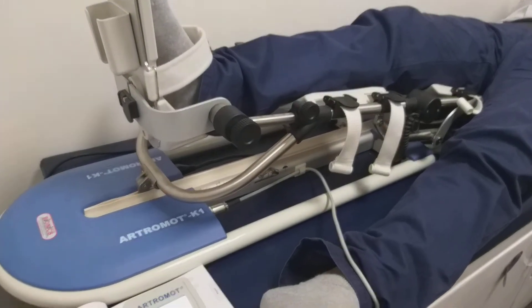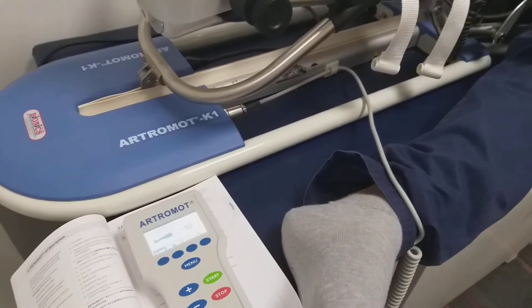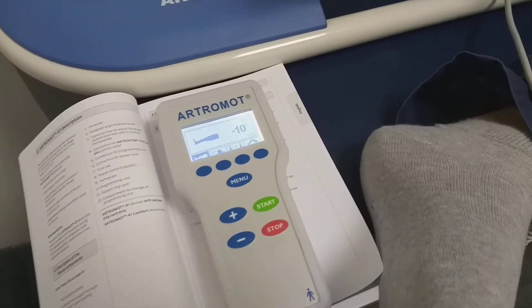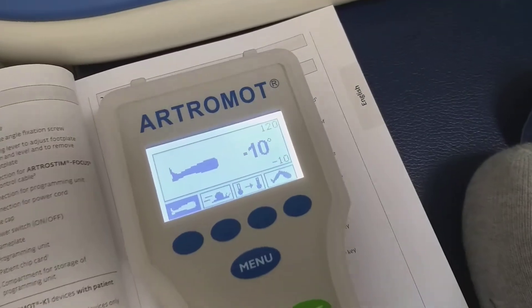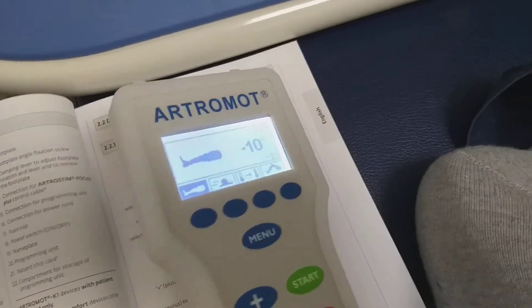This is the Artromot CPM knee and hip from DJO Global. Here you can set the angle between minus 10 to 120 degrees. Extension is minus 10 and flexion is 120.